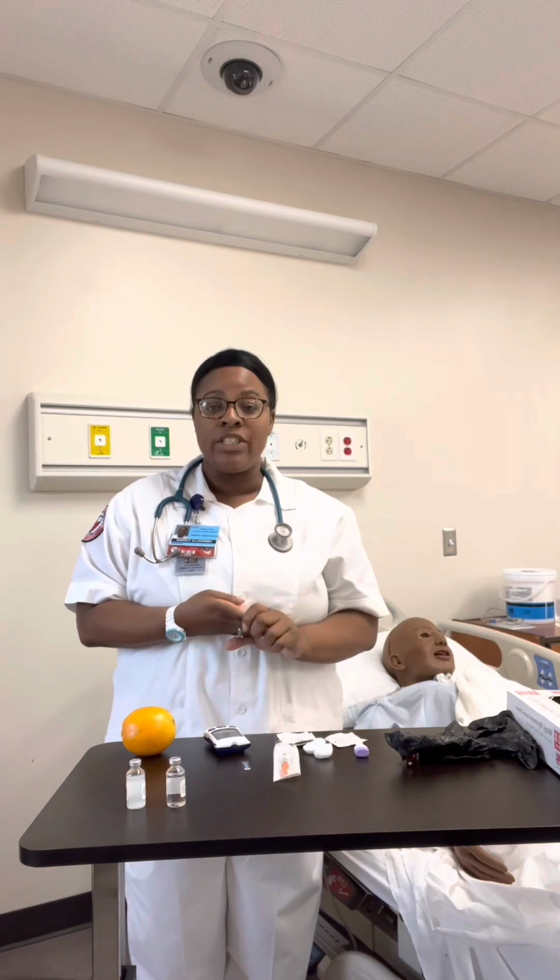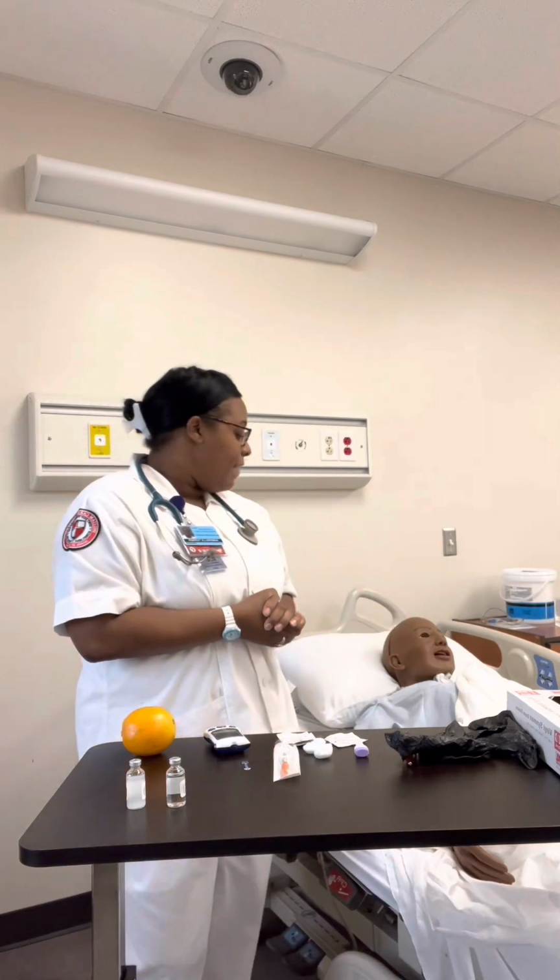Prior to mixing and administering insulin, I need to be aware of the 6 rights of medication administration. You need to have the right route, the right dose, the right medication, right patient, right time, and the right documentation. Insulin can be administered via insulin pen, subcutaneous, insulin pump, or insulin injection. At this time, I'll be demonstrating mixing and administering insulin.